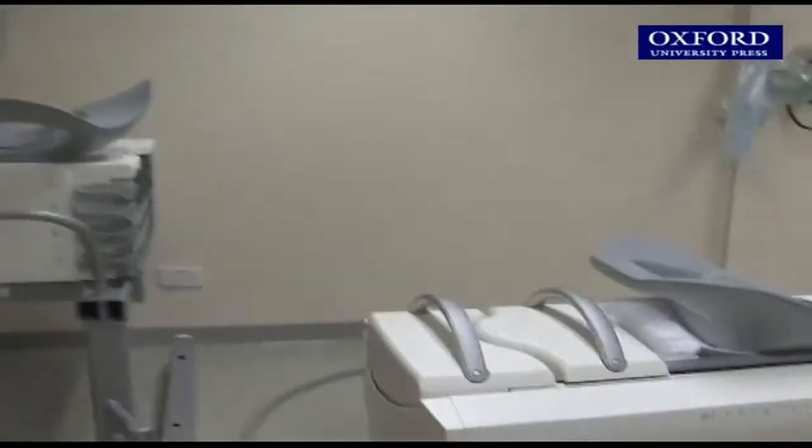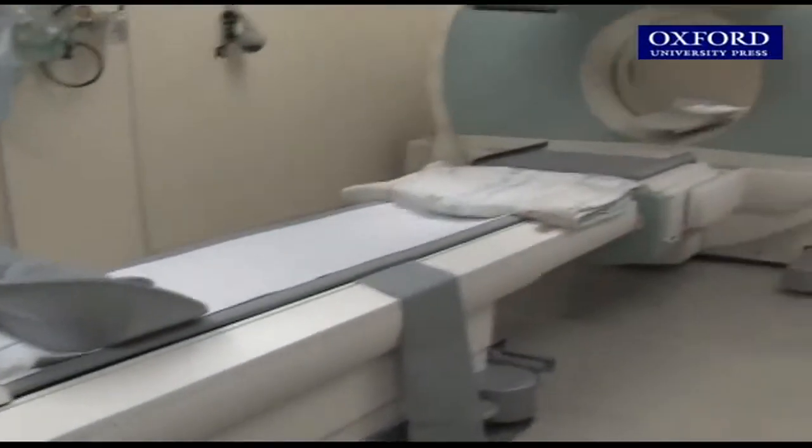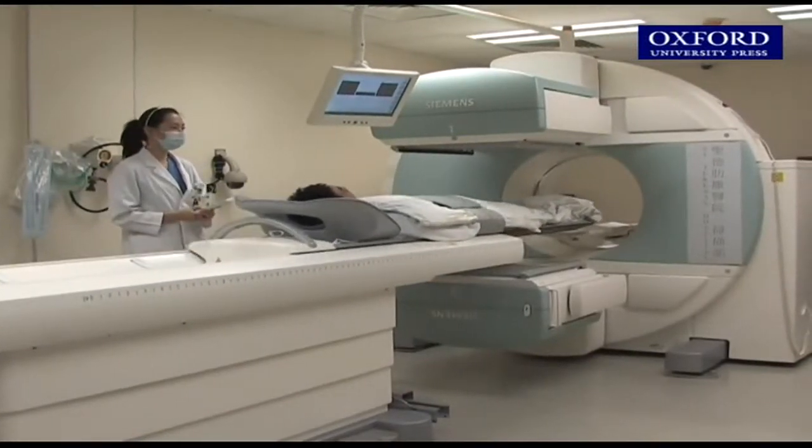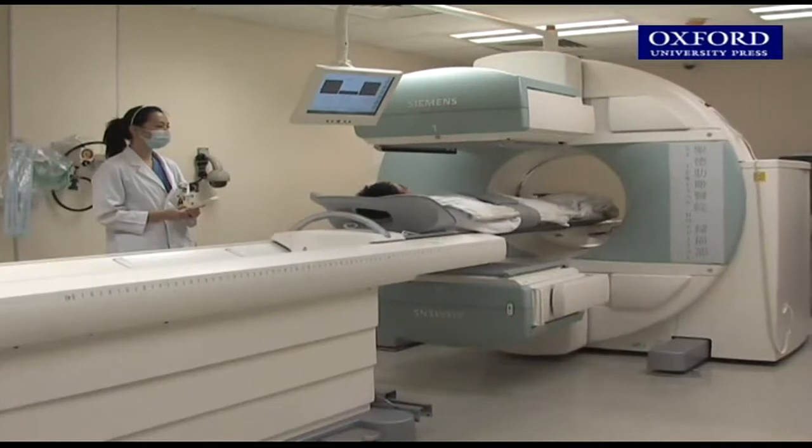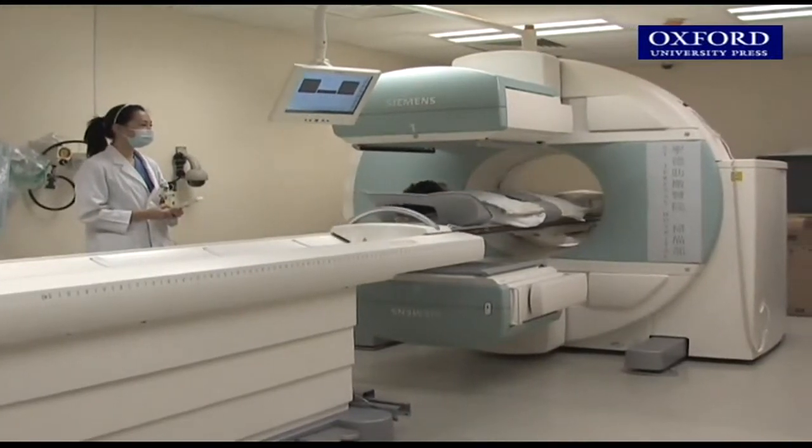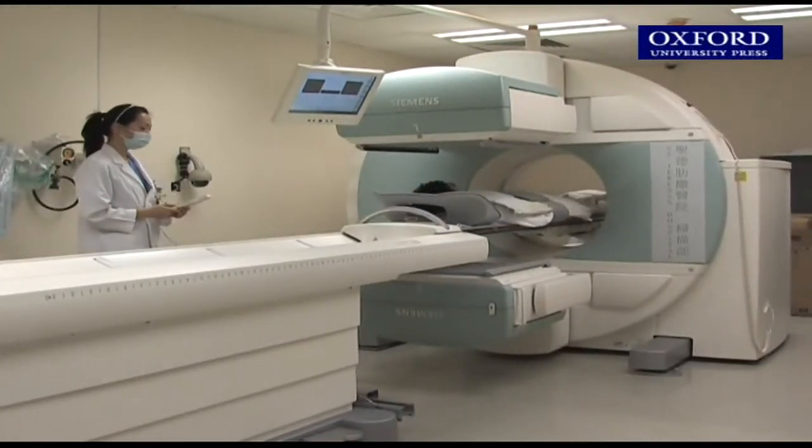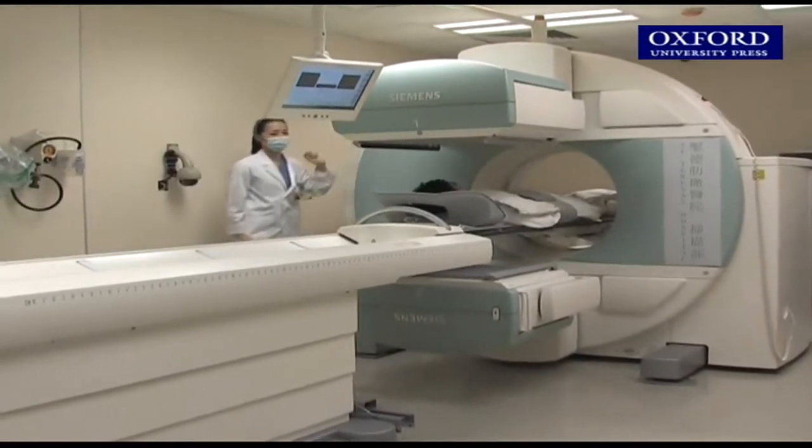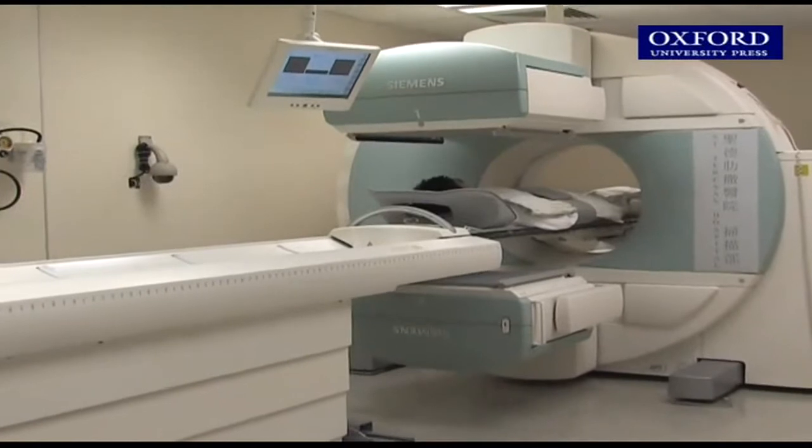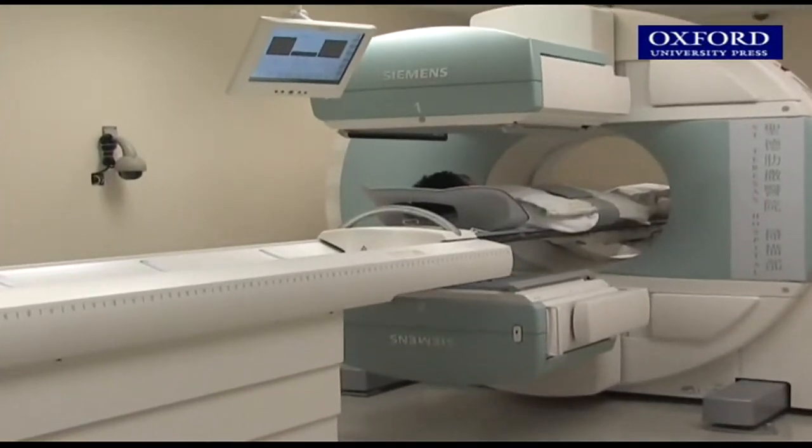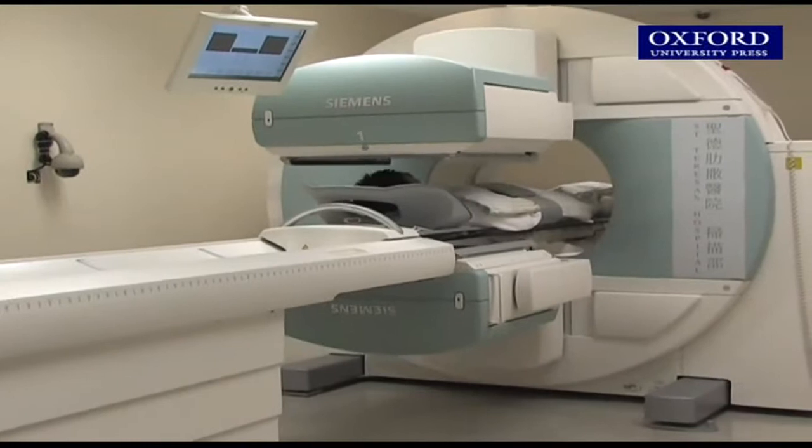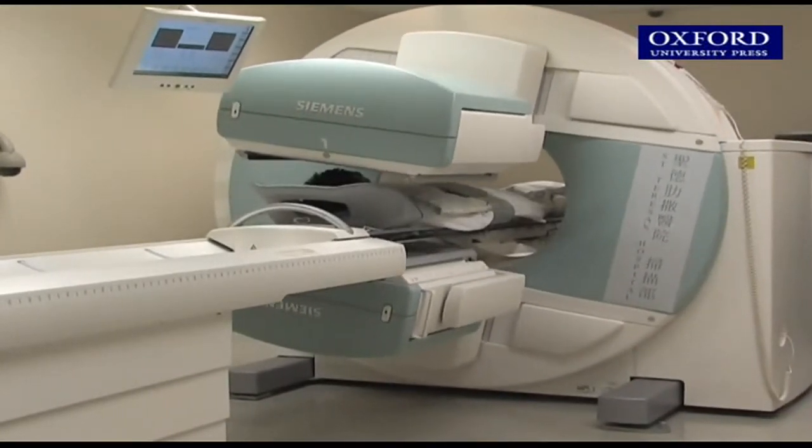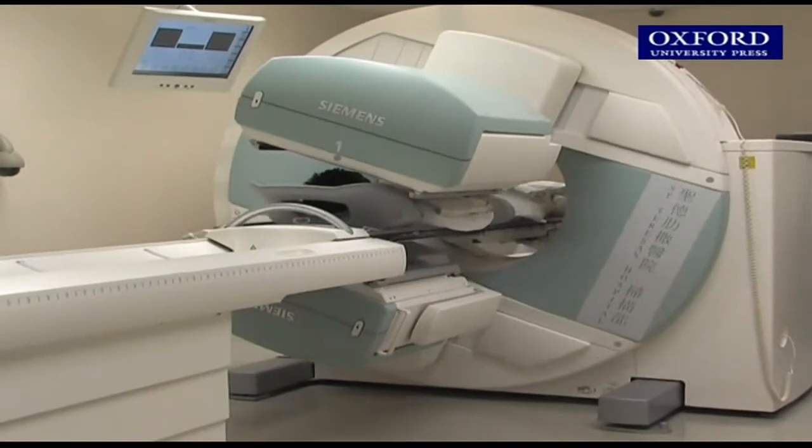This is a gamma camera. It's connected to a computer. A pair of detectors, each located on the top and the bottom, can detect the gamma rays emitted from the patient's body. The computer will then transform the result to images. During the imaging process, the patient is sent through the gamma camera. The detectors rotate around the patient to collect data.